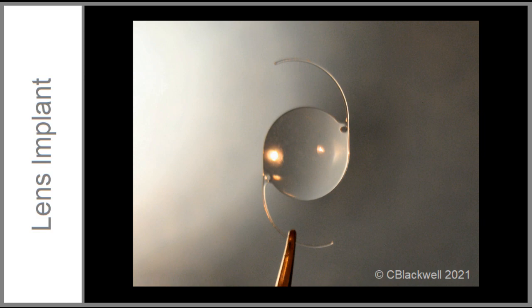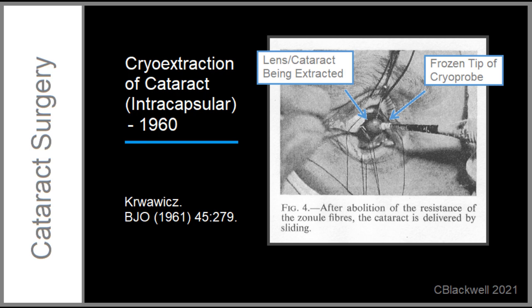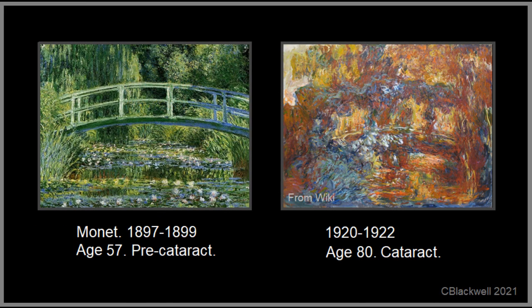Let's start by recognizing that the intraocular lens implant is a marvel of modern medical technology. Up to the middle of the 20th century, cataract surgery was less than terrific. The procedure to remove the lens was not very refined, and rehabilitation of vision was very basic. So much so that the decision for surgery occurred when vision was reduced to the point where there was nothing left to lose.